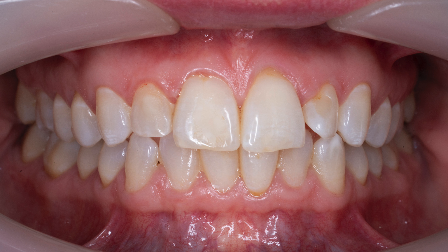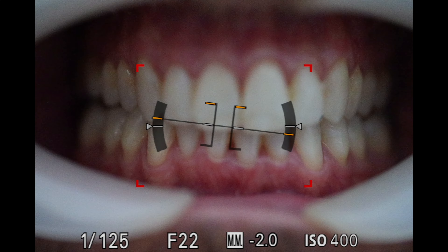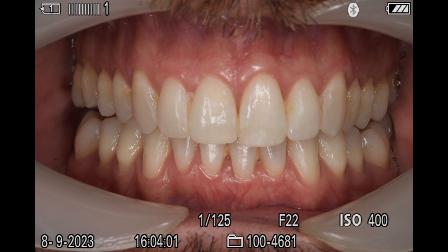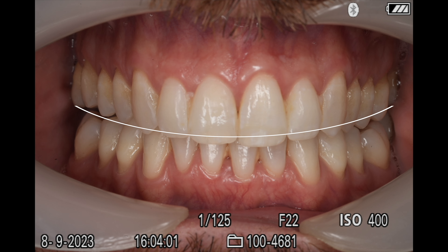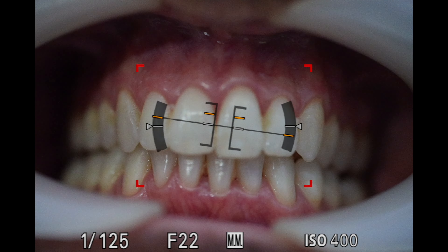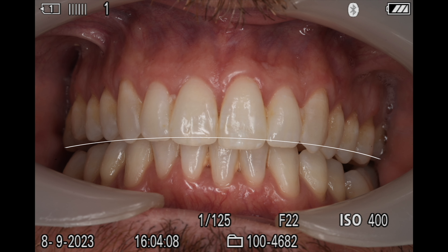How can we ensure we get the same angle every single time? We need a reference point, and the best reference point is the occlusal line. When we take an intraoral image, we are aiming for the occlusal line to be straight across and in the middle of the frame. If you're looking too far down, the occlusal line will take the form of a smile. Similarly, if you look up, the occlusal line will be an upside down smile.